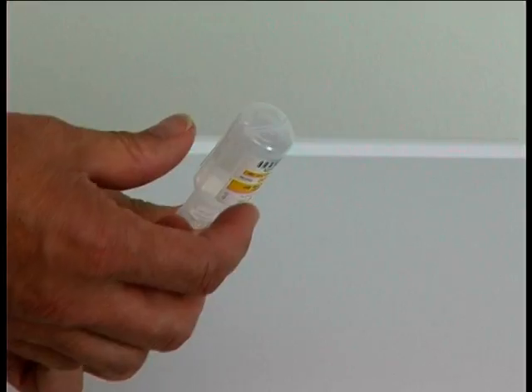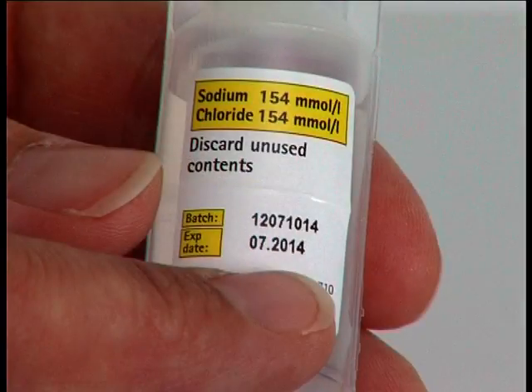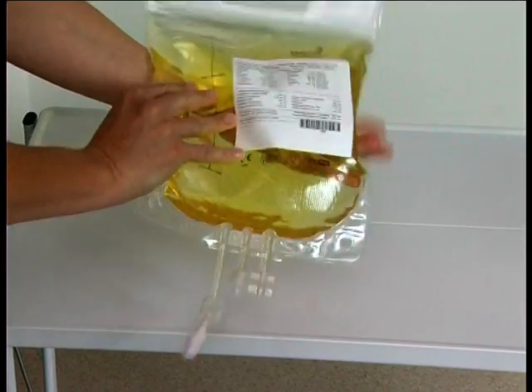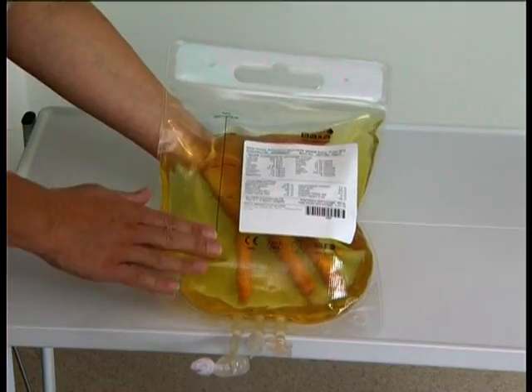Check that the vials are not damaged in any way or leaking, and make sure that the contents label is correct and the expiry date is not passed. Check the infusion fluids to make sure that they contain the expected amount of fluid, are a similar colour as usual, and you cannot see any large particles in them.